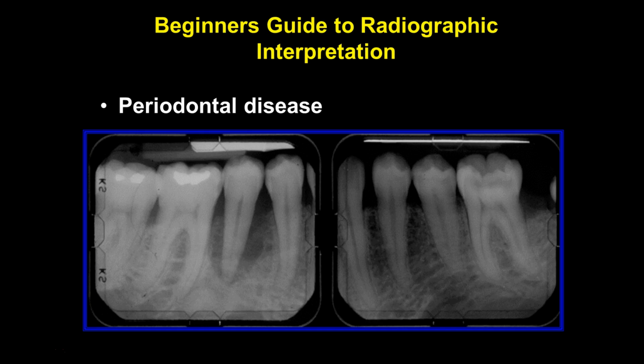Periodontal disease again continues. Periapical radiolucency surrounding this tooth. Something's not okay with this area, obviously. And the significance of this too is this is what we call a virgin tooth. There does not appear to be anything that is causing this tooth to do this. The first thing that comes to mind to me would be to ask the patient if they remember anything abnormal happening here.